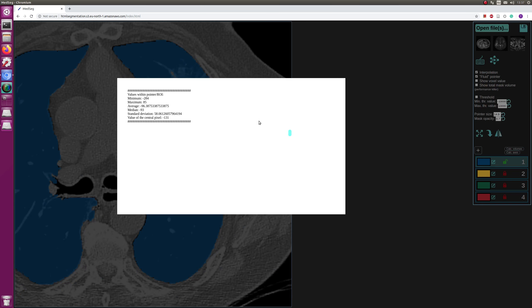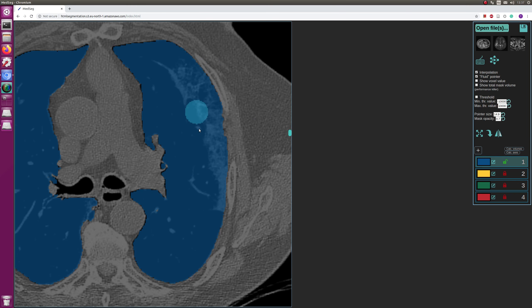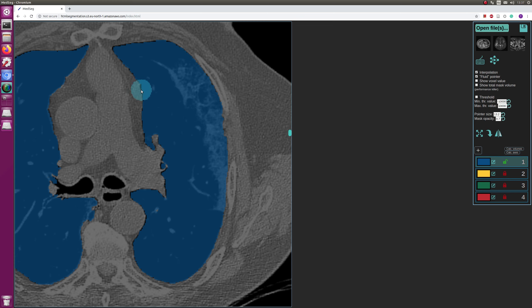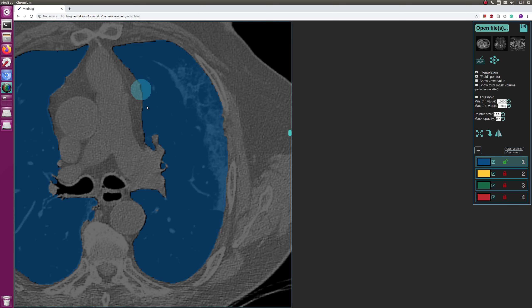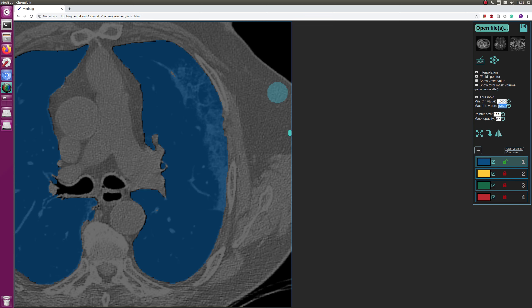So within this bright blue circle over here you can see the average values minus 300 Hounsfield units, areas minus 1000 approximately. And if you would look at the fat around here it's at minus 100 approximately. So what I want to do is I want to set the max thresholding value to something within the middle of this circle because I want to threshold only half of what's inside. So you can see the average is minus 520, and if I hold the mouse here and press the plus button, it will automatically set the thresholding value to the average within the circle.